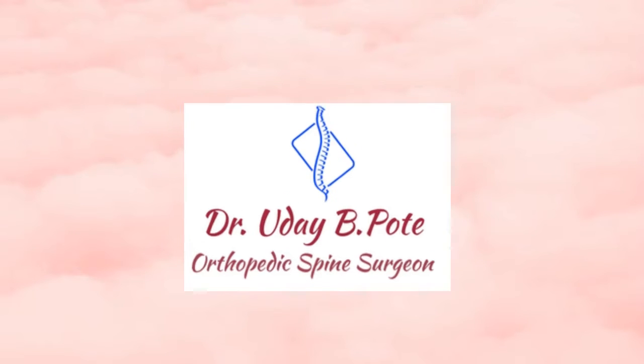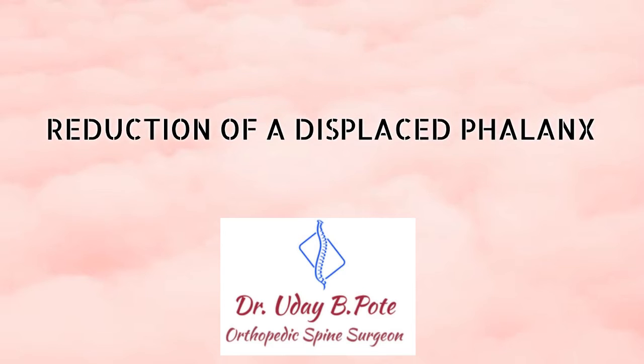Hi, I am Dr. Uday. In this video, we will be watching a case of displaced fracture relocation.